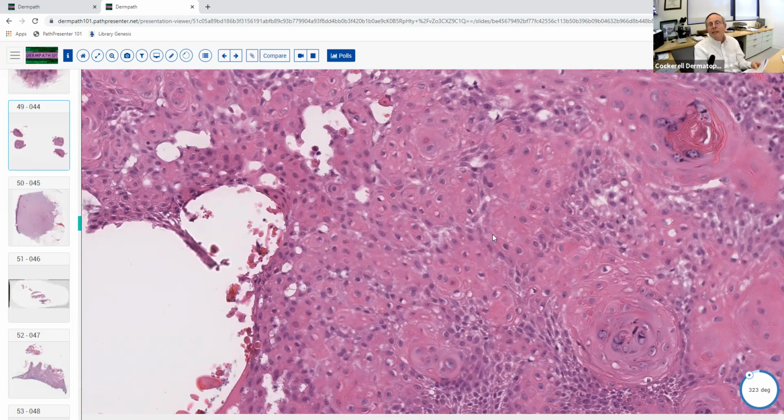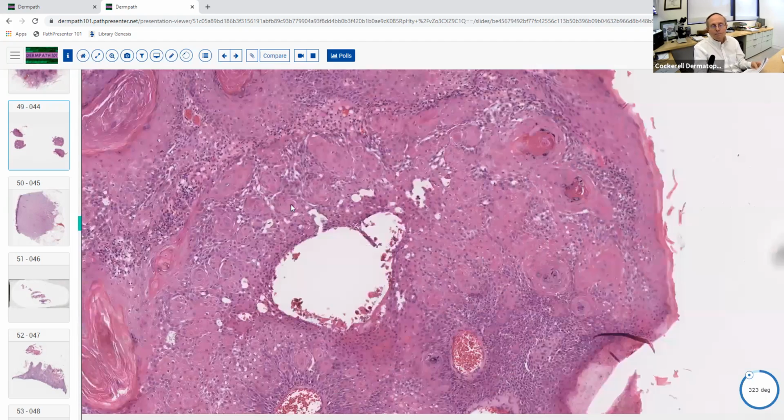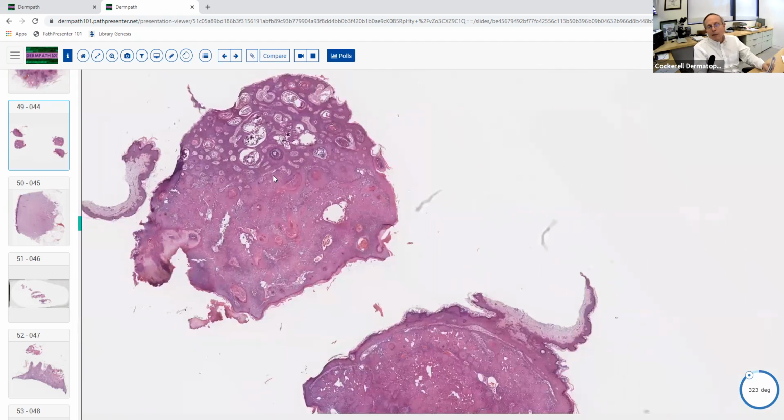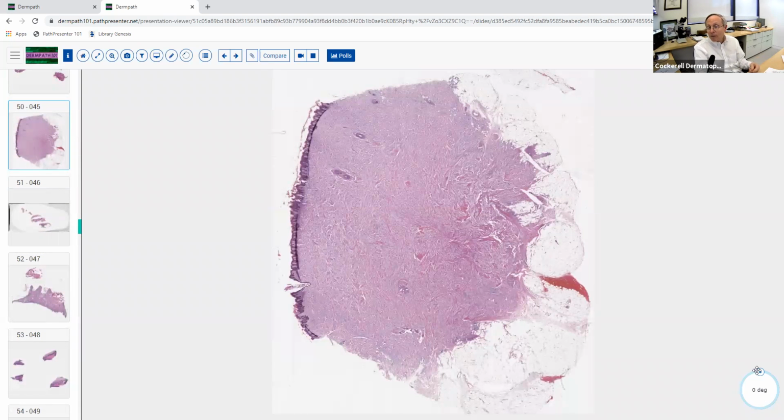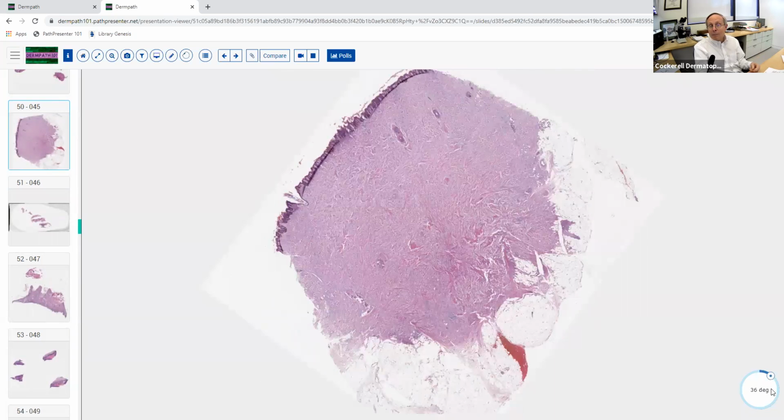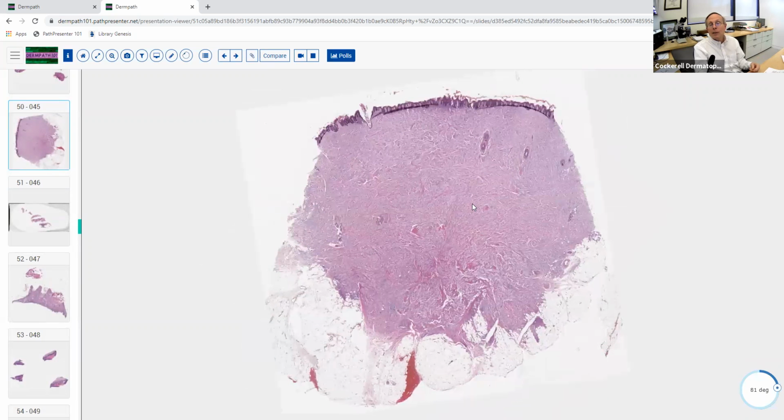And clearly it's not prurigo nodularis. So hopefully everybody got this right. It's pretty straightforward. And again, sometimes the board examination will give you some easy things. Not everything is going to be tough. Now, this one might be a little harder for you. You might have had to kind of look at this and scratch your head a little bit, but this is a very good case of this lesion, and this could very easily be on the exam. So this is fair game. They could show you this.